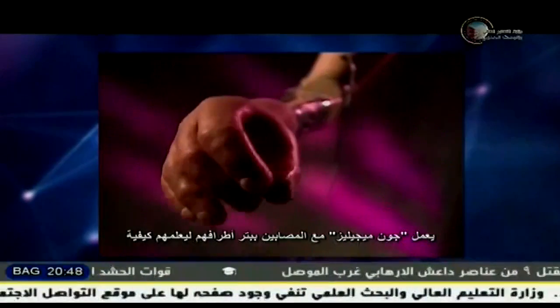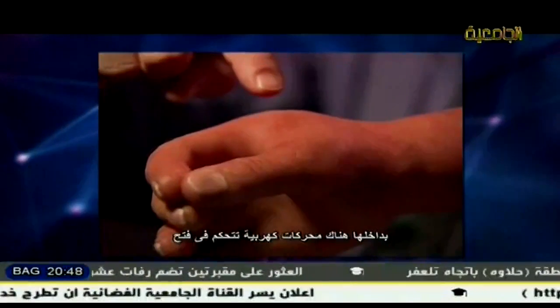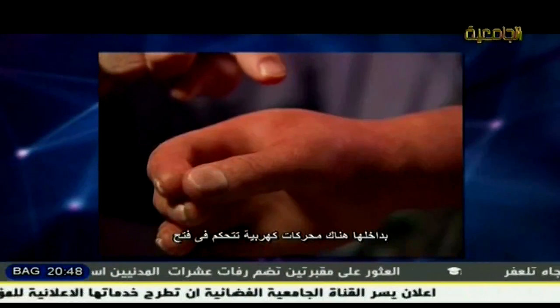This is a Utah arm, one of the newest links between human and machine. The device uses the body's own electrical impulses to operate and control an electrical arm. John Migueles worked with amputees, teaching them how to use and operate the myoelectric arm. Right now there's a race between limb transplant and electronics.